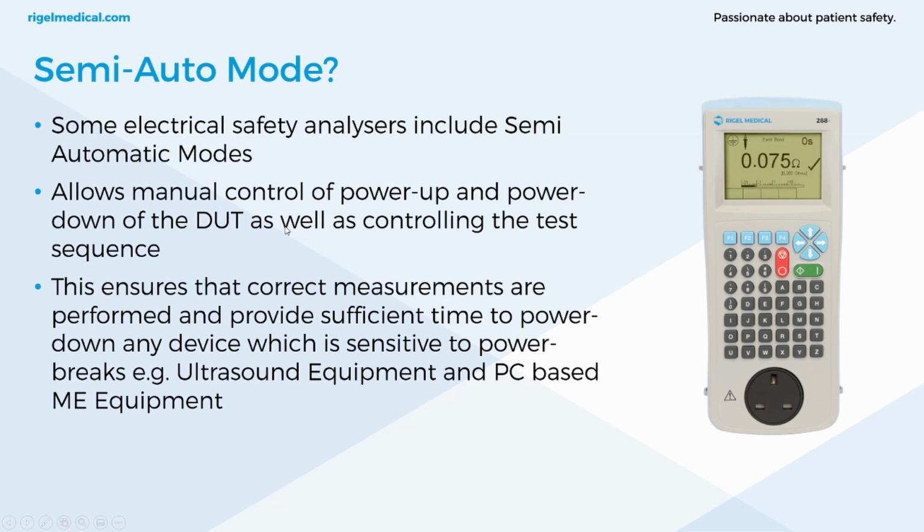This allows for manual control of power up and power down of the device under test, as well as controlling the test sequences. This ensures that correct measurements are performed, and it provides sufficient time to power down any device which is sensitive to power breaks, e.g. ultrasound equipment and PC-based medical electrical equipment.